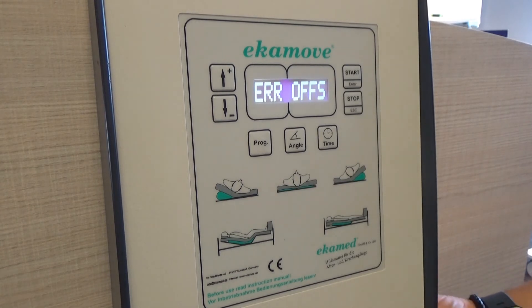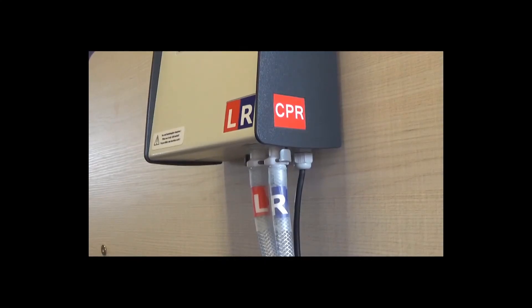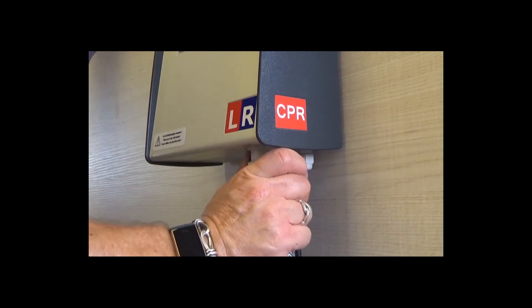For all other error codes, you will be required to restart the device and information can be found in the user manual. To handle a CPR emergency or to deflate the system quickly, squeeze the clips on the air tubes where they connect to the control unit.